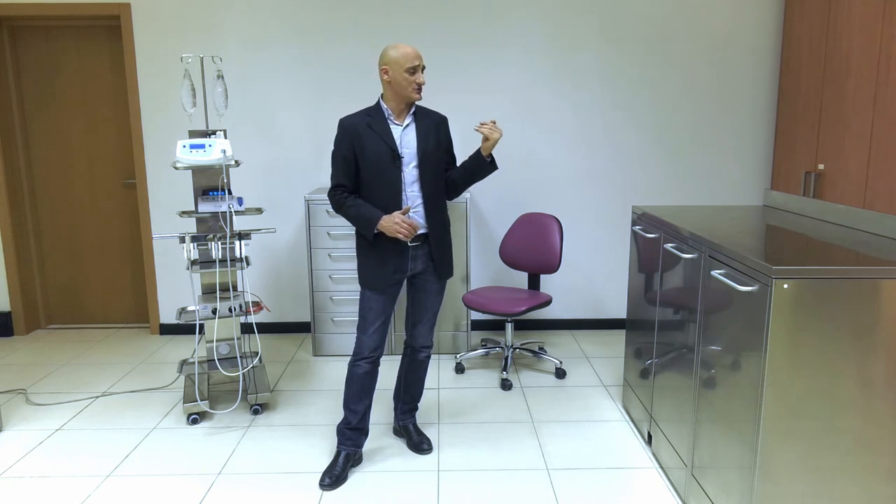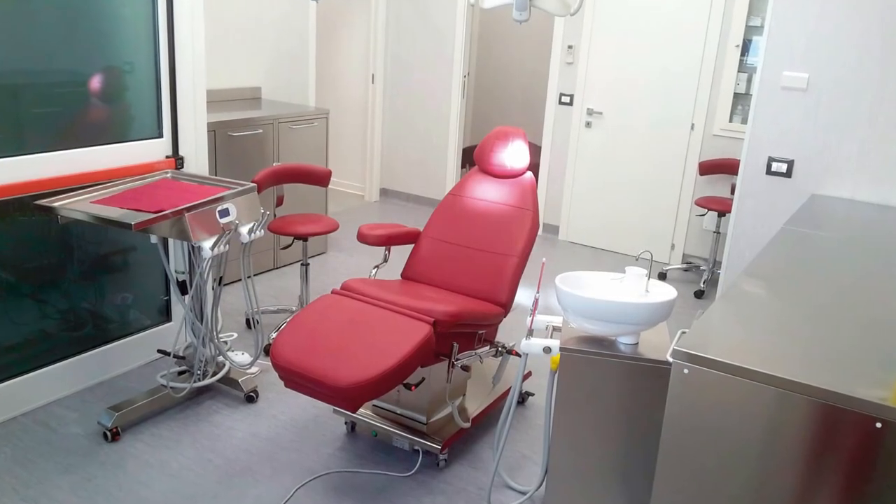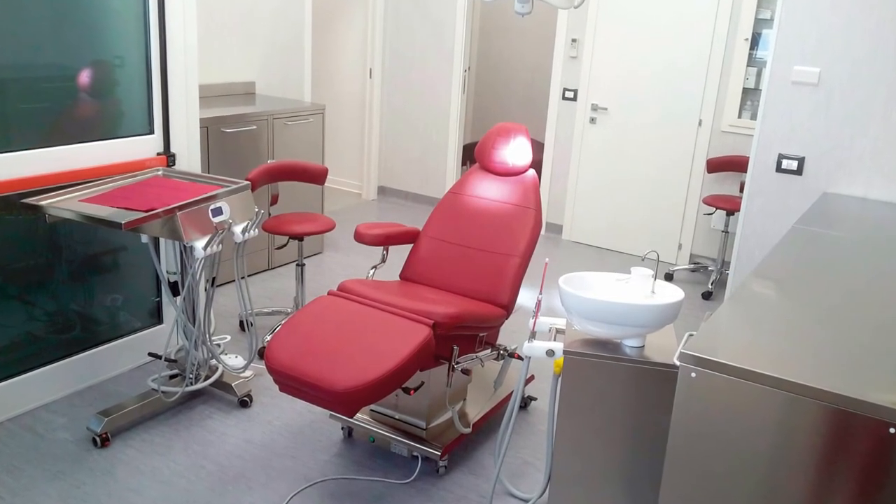You have seen the cabinet placed at the left of your chair, though you can as well place it behind it or in any other position. In any case, based on your specific requirement, we can assess the best position for it.